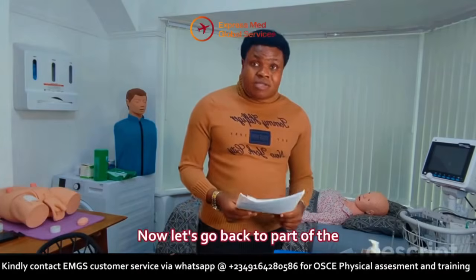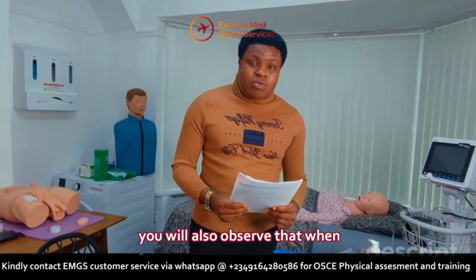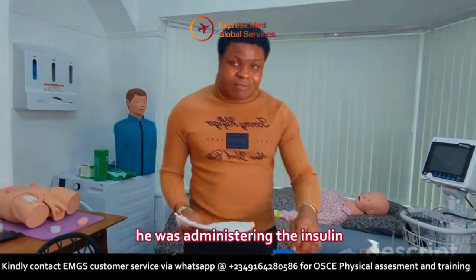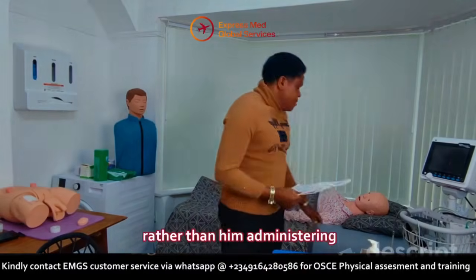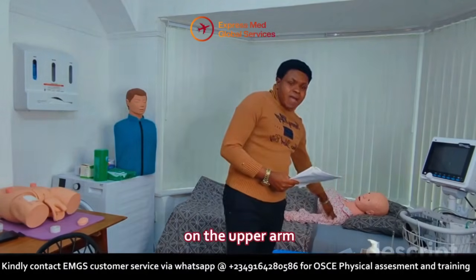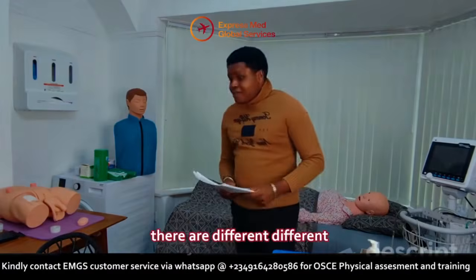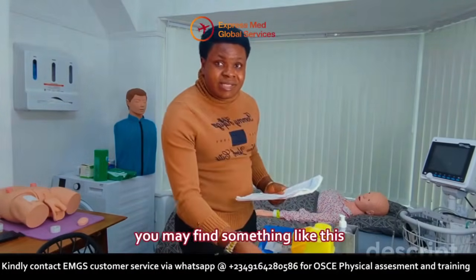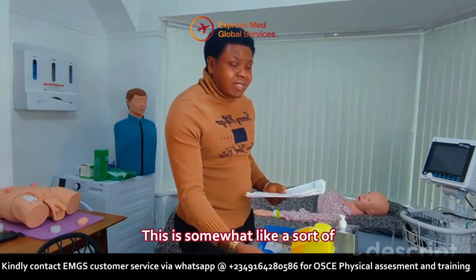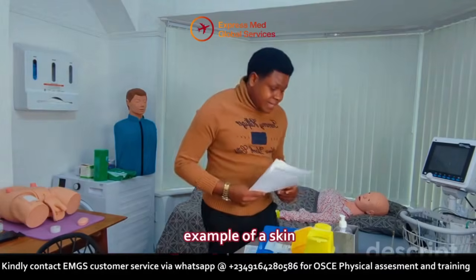Now, let's go back to part of the tips that you should be aware of. You will also observe that when he was administering the insulin or the medication, rather than him administering on the upper arm, I told him that the skin is right here for him to use. So in your OSCE center, there are different types of skin you may find. So you may find something like this. This is somewhat like a sort of a skin.